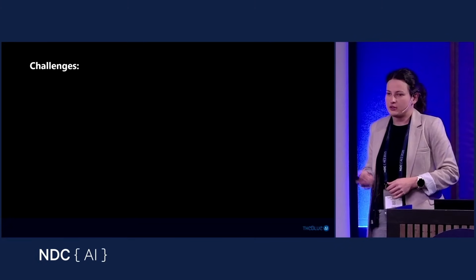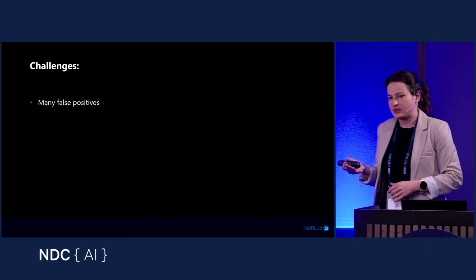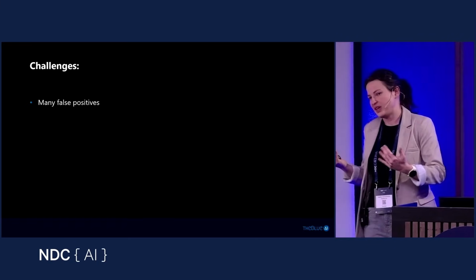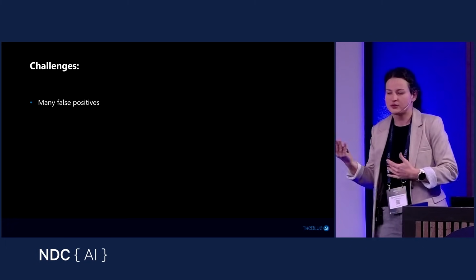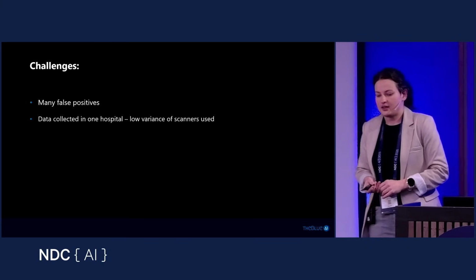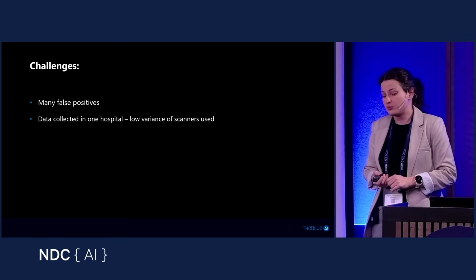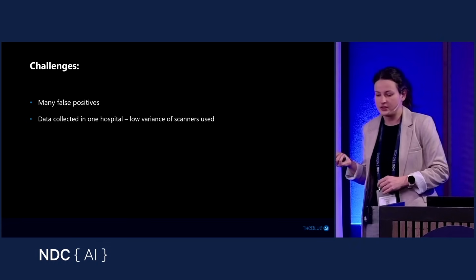So we're left here with some of the challenges. We have quite many false positives, which makes the tool a little bit useful for the initial screening, but still giving you too many false positives is like lowering your attention level. We have data collected only in one hospital, so the variance is quite low for the different scanners.